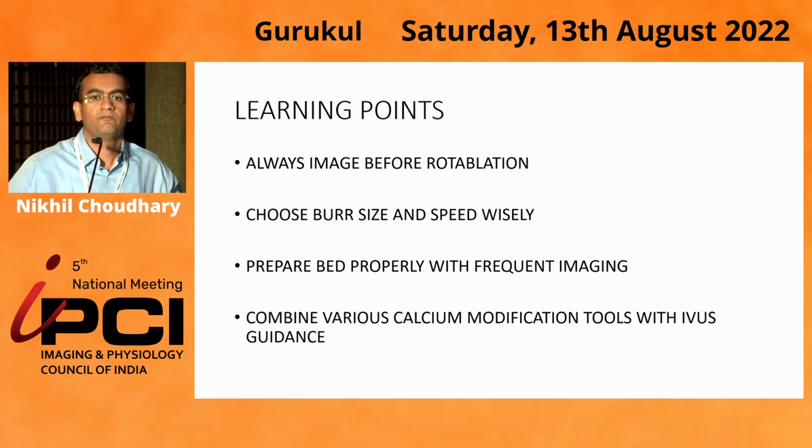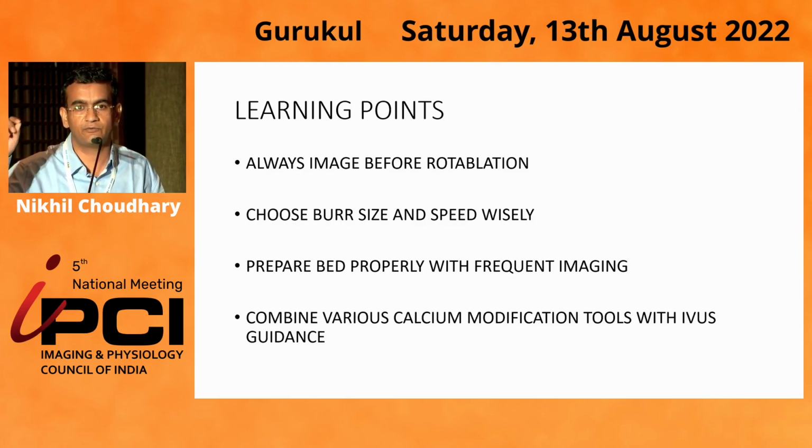What was the ejection fraction? It's 45%. So that's why you didn't think of using any hemodynamic support device. Yeah. Such a complex case, and that left main to LAD bend was very nasty. A perfect recipe for a possible problem. I agree. I was thinking of all possible complications that could happen: stuck burr, perforation. But I guess if you take a stepwise approach, doing each step, you'll be able to do the job most of the time.